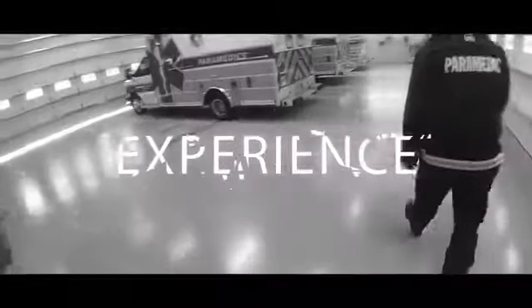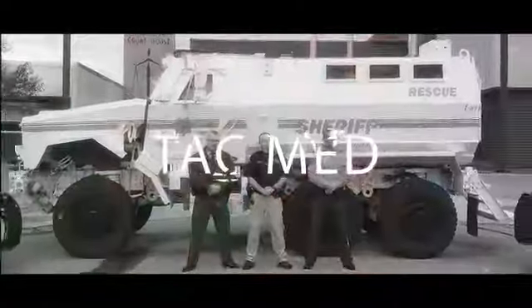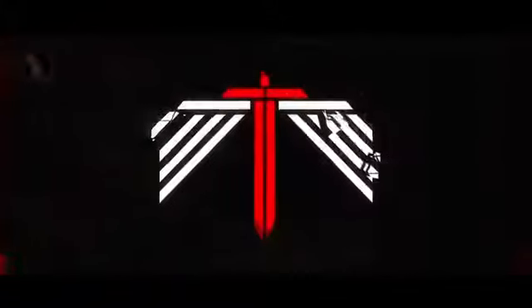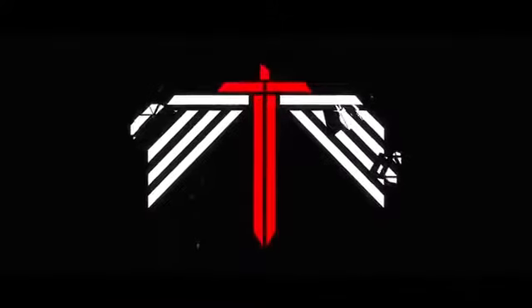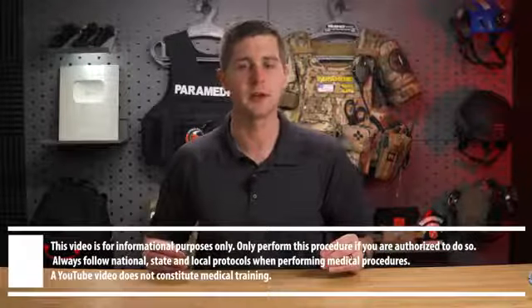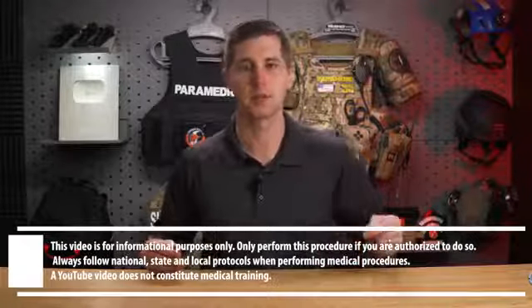In this week's video, we are discussing how to perform an emergency cricothyrotomy. A surgical cricothyrotomy is an invasive procedure that involves cutting the neck at a specific point and inserting a breathing tube in an effort to provide a definitive airway and bypass some of the structures of the upper airway.